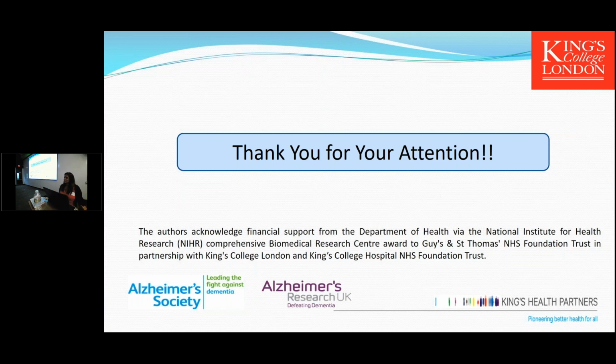Thank you. Have you performed your texture analysis on individual brain regions of interest? So I think what you showed was whole brain. Yes, so for the purpose of the PhD work, it was done on a global brain, partly because if you're trying to look at small areas, you have partial volume effects, so the whole brain was taken as a whole.